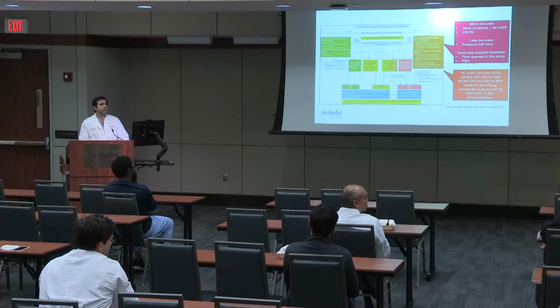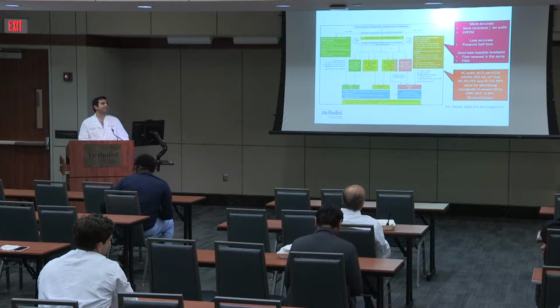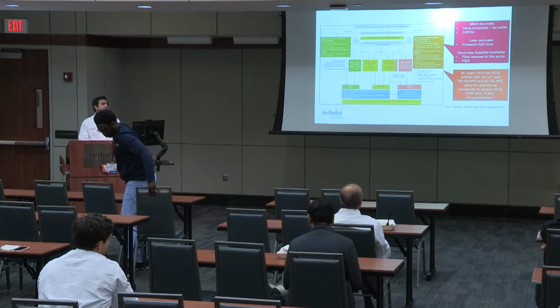So in these validation studies that you showed, what was considered a significant fraction based on CMR? Like, what was considered severe? For this one? Yeah. Here we use the current numbers. So we gave a little bit more weight to regurgitant volume, but as you know, reading all these scans all day, someone can have a regurgitant volume that puts them in the 3+ category, but their fraction puts them in 2+, and vice versa. So we gave more weight to the regurgitant volume for these particular discrepancy cases, but otherwise it's the same numbers.